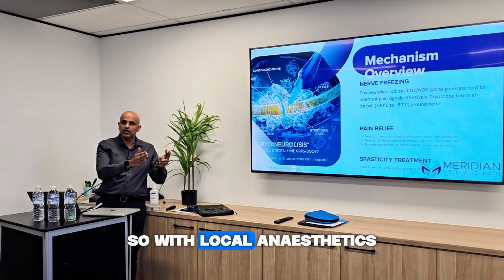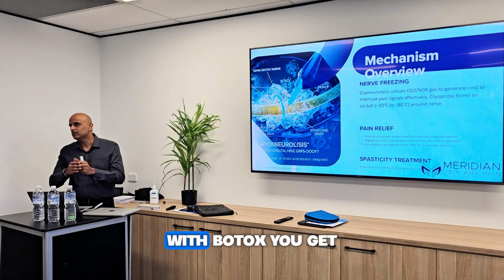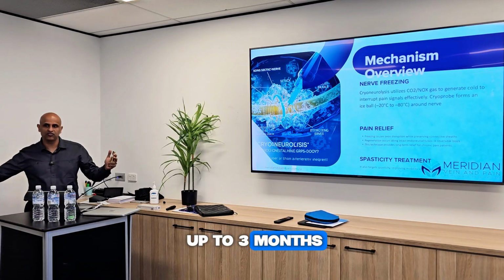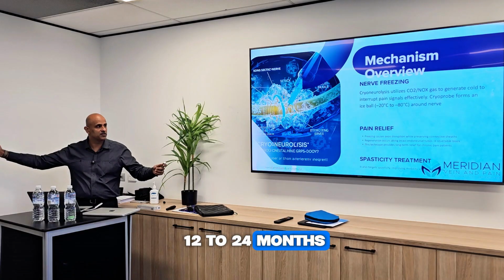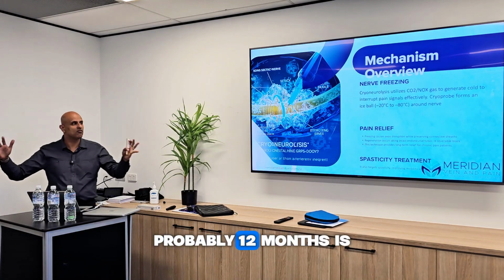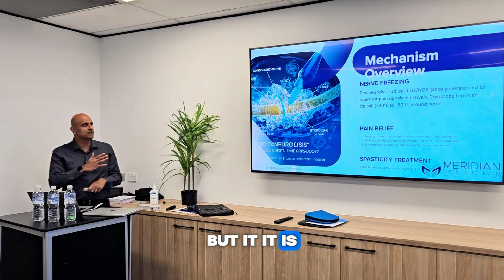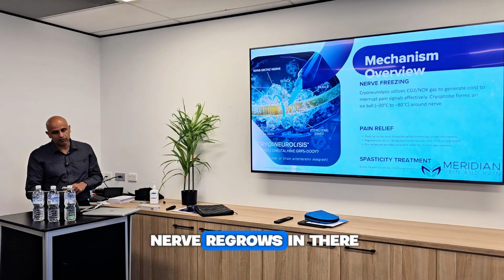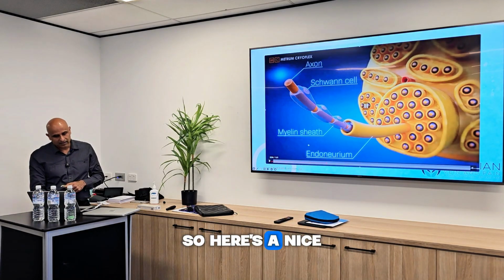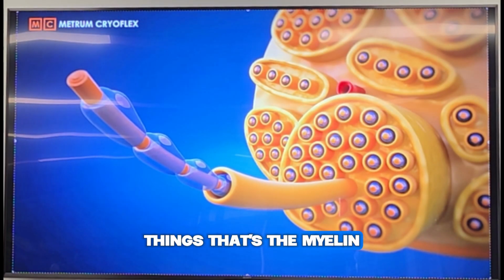So with local anesthetics, you get a 6 to 12 hour block. With Botox, you get up to 3 months. With cryo, you get anywhere between 12 to 24 months of pain relief, or probably 12 months is much more likely. But it is a much better way because the nerve regrows. So here's a nice little thing. So that's the myelin sheath that we're looking at.